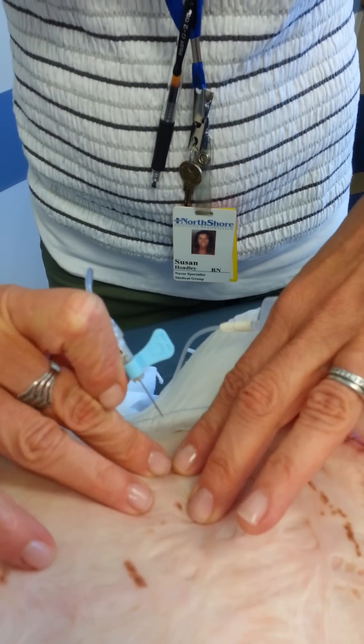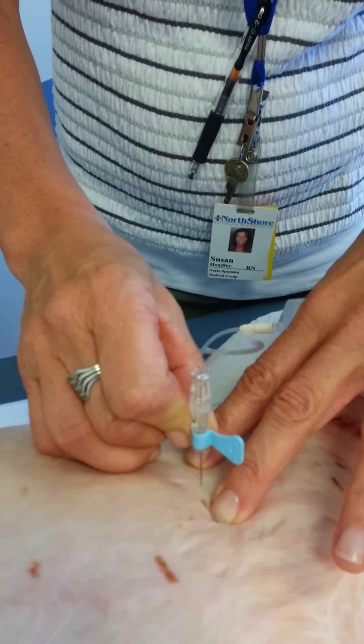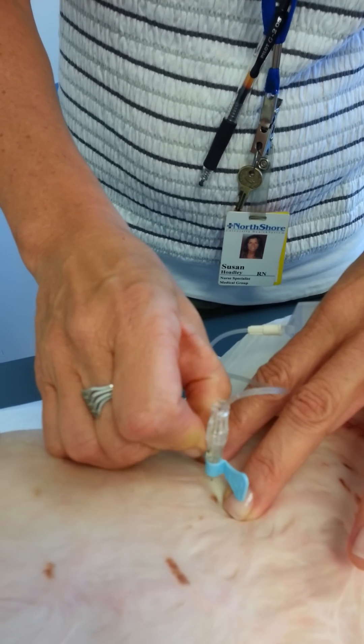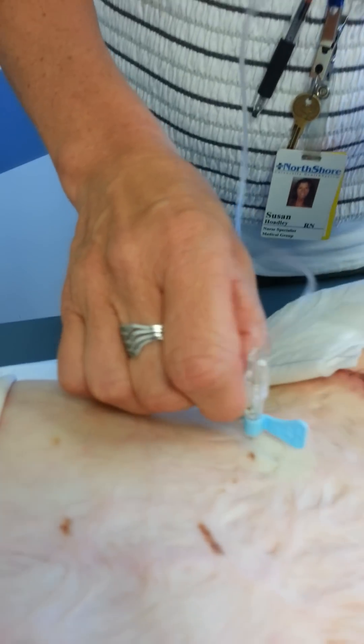As long as I go right in the center of this, which I think is right about there, and I'm spreading. Here's the stick — it's going in, it's going in. There we are. Did you hear that plate? Yeah, I heard that click.